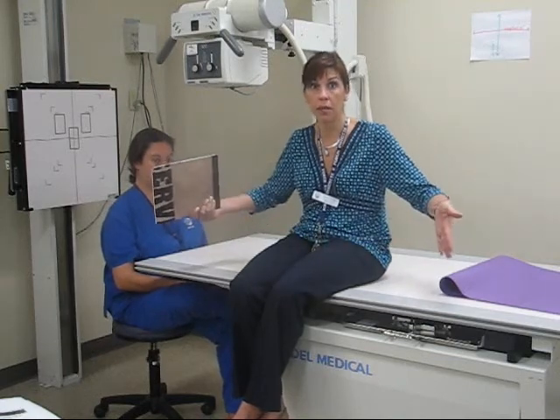So if it's a hand, probably an 8x10 will do. If it's a chest, you're going to need the biggest one you can get, or an abdomen, which you're not even really concerned with right now. Femur, for example, you're going to want the biggest IR. So don't spend a lot of time trying to memorize stuff that you can rationalize about.